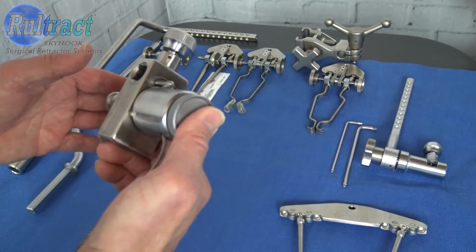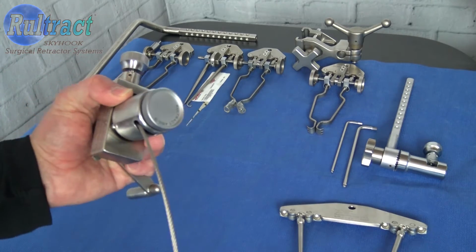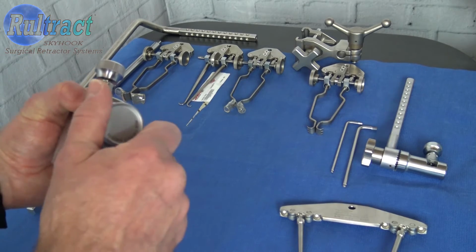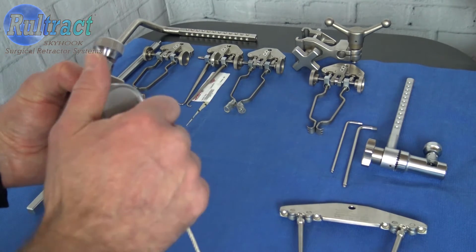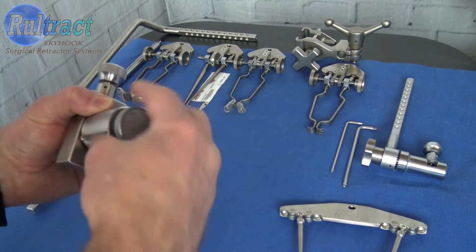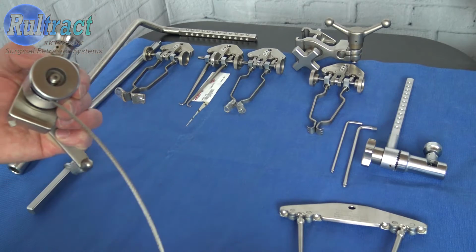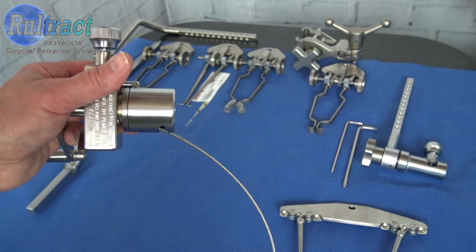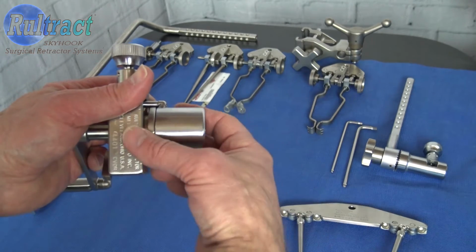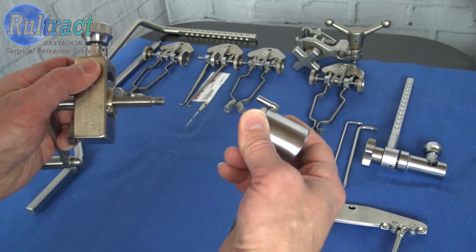Now to do that, you're going to reverse your grip and hold this ratchet assembly by the handle. Go ahead and grab your spool cap nut, and without using a tool, just use your hand, turn it counterclockwise all the way until it comes off. Next, we're going to remove the spool cap assembly from the crank handle and gearbox. And to do that, just go ahead and grab your spool cap assembly, slide it right off.